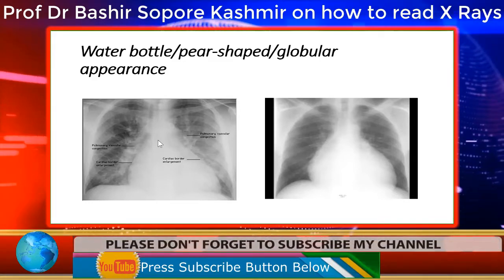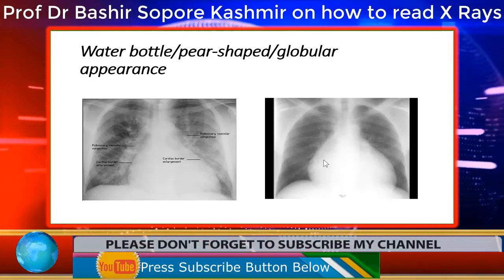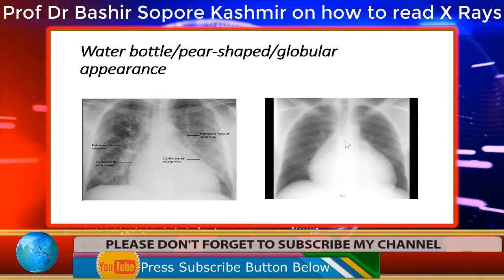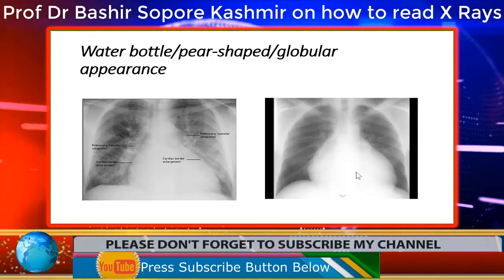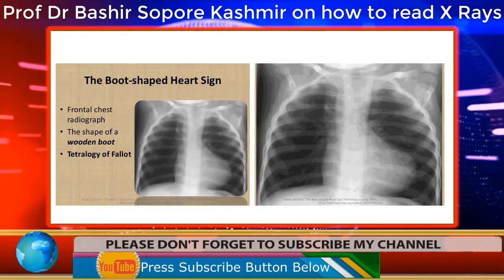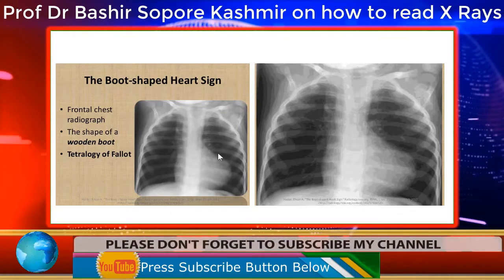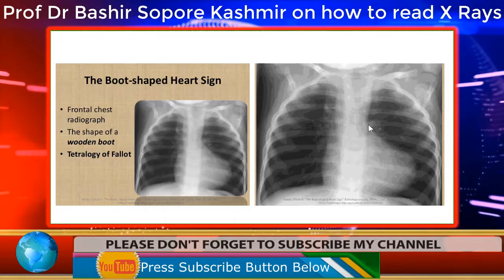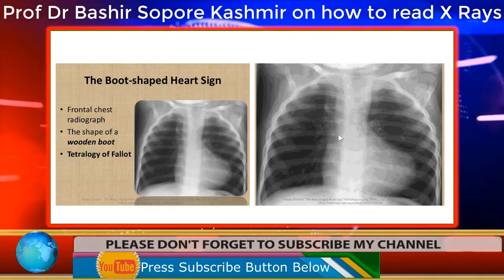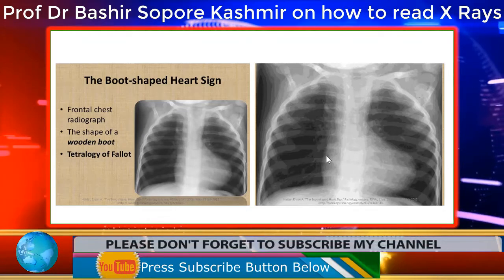This is usually found in cardiomyopathies or pericardial effusion. So you can also see here the water bottle appearance or globular appearance. There is cardiomegaly, and this is typical of pericardial effusion or cardiomyopathy, that is dilated heart, dilated cardiomyopathy. Or you may find that the heart is boot-shaped. If you see here, it appears like a shoe or like a boot, right? And this appearance is seen in Fallot's tetralogy, which is a cyanotic congenital heart disease.